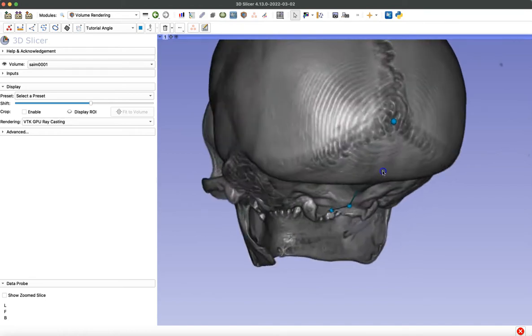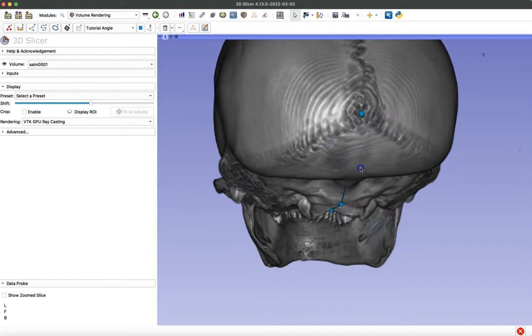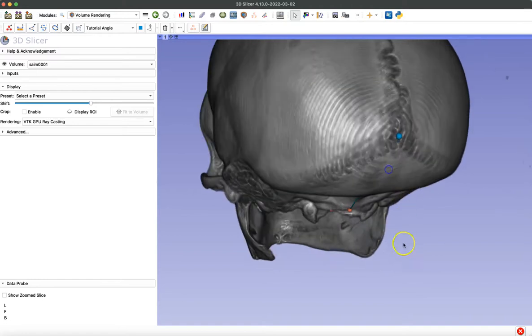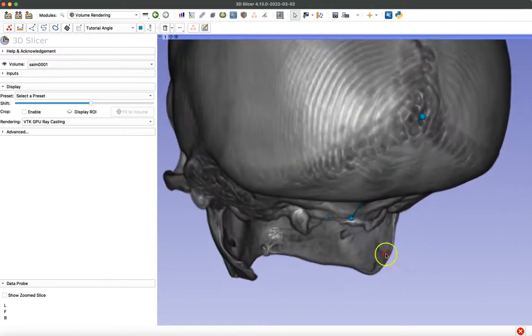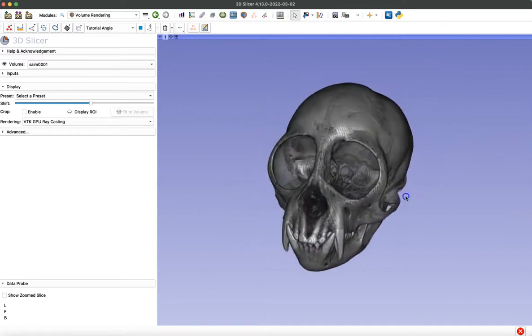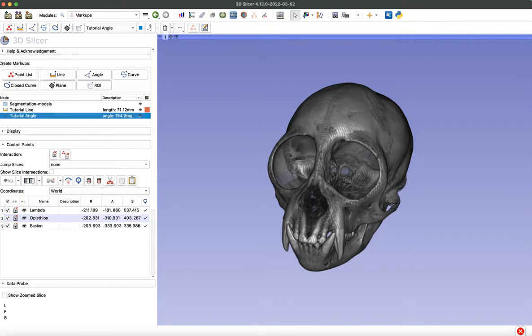So you can still adjust those points even at this point in the process. So when you navigate back to the markups module, you can see our final length and angle measurements right there.